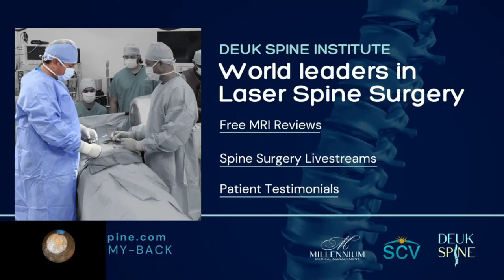If you have a herniated or bulging disc and neck pain, submit your MRI for a free review at www.mri.deukspine.com.